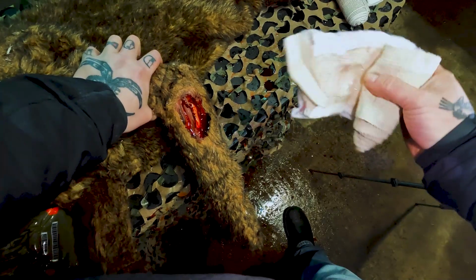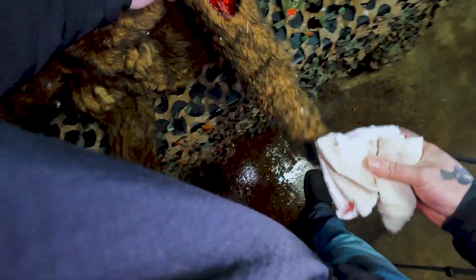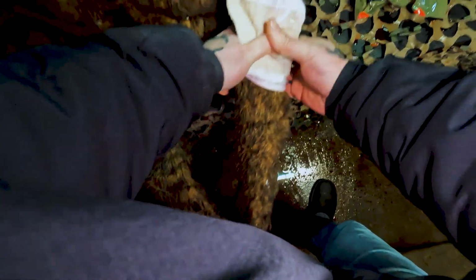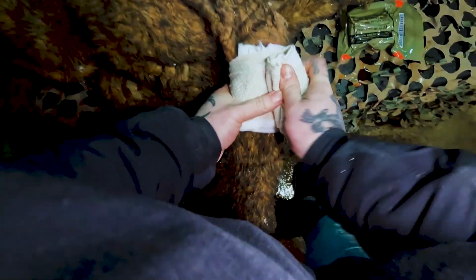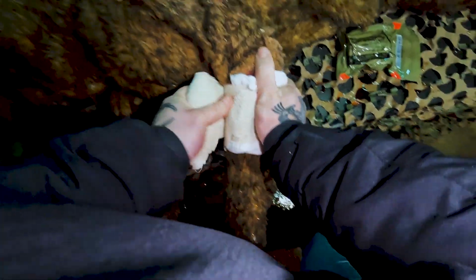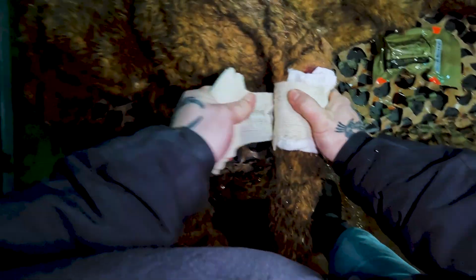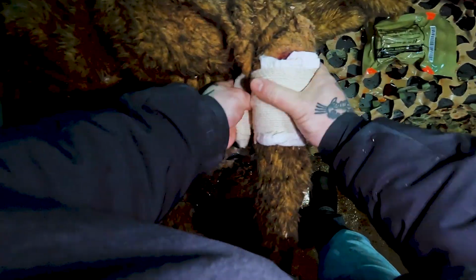One of the easiest ways to do that is taking either your Olaes dressing, or if you have an emergency trauma dressing, and covering the wound that way. Grab the leg, treat the injury. Place the bandage over it, applying pressure, and then tightly wrap that around the injury. Keep it covered to stop the bleeding.